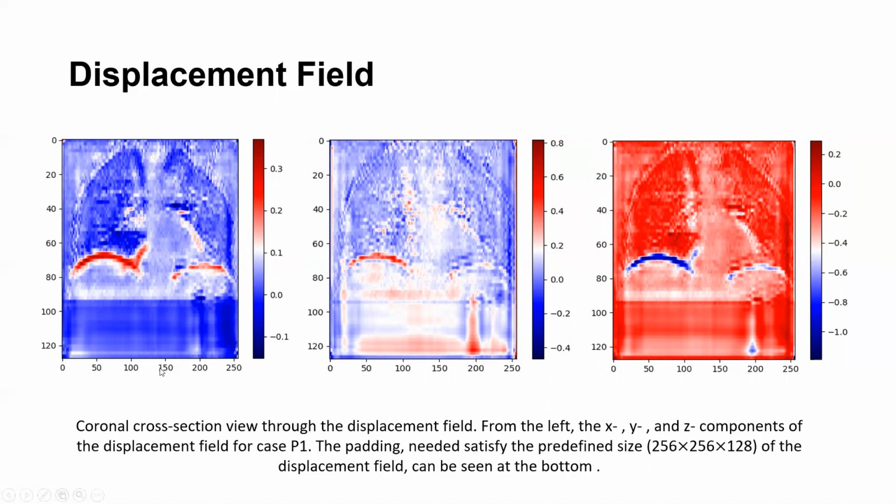So we needed to pad the rest of the volume, and apparently the model found it a kind of strange way of feeding the data and provided us with more error than usual for this case. Although it tried to perform properly in some places during the registration, as shown next to the diaphragm area.